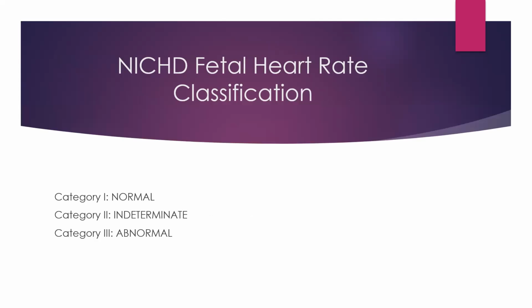So as we monitor our fetal monitoring, every time we do a fetal monitoring update and chart it in the computer, we're also determining and assigning a fetal heart rate classification or category. And there are 3 categories, category 1, 2, and 3. Category 1 is normal, absolutely normal, nothing to do there. Category 2, it's indeterminate how well the baby is doing.